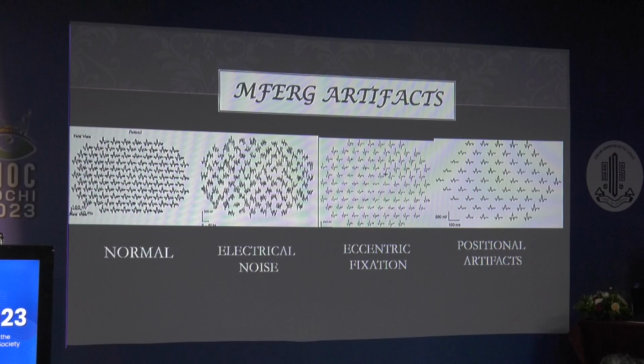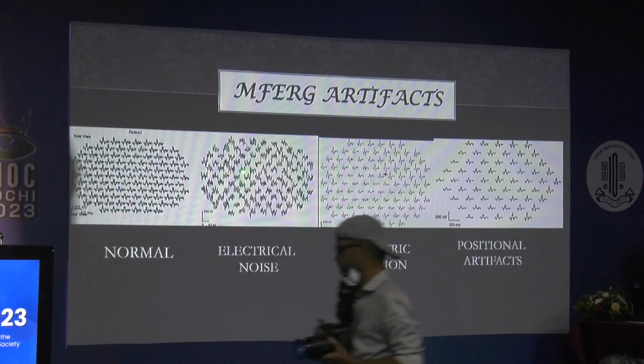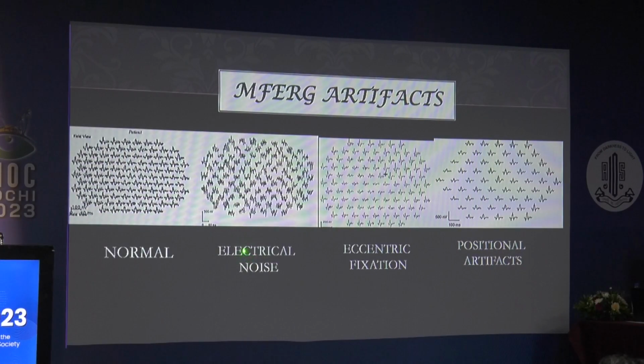So artifacts should be kept in mind. This looks nice, this is normal. You may think that this also has some responses. Actually, when you see this kind of peaked responses, this is largely electrical response, and you should look whether any electrical noise is interfering with your ERG.